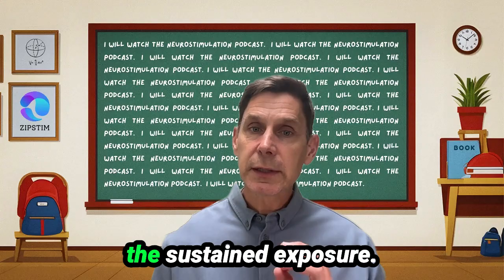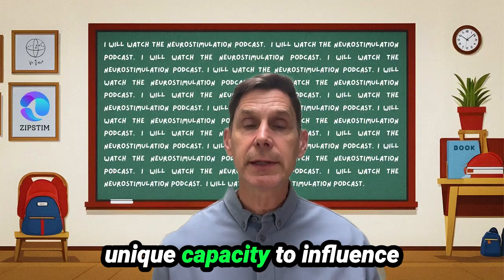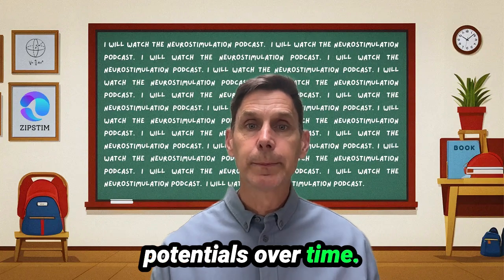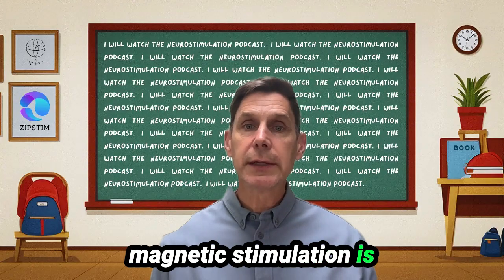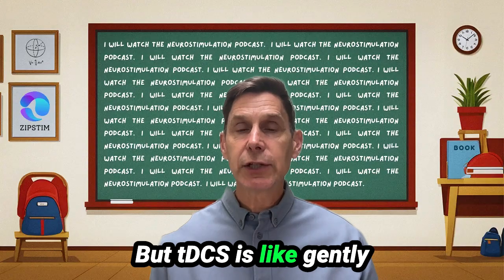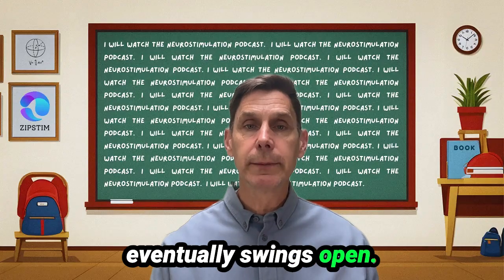And this sustained exposure is what gives tDCS its unique capacity to influence neuronal membrane potentials over time. Here's a practical analogy. TMS, or transcranial magnetic stimulation, is more like ringing a doorbell, but tDCS is like gently pushing the door continuously until it eventually swings open.